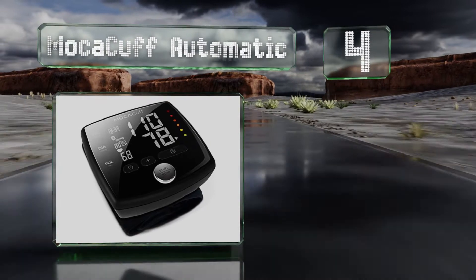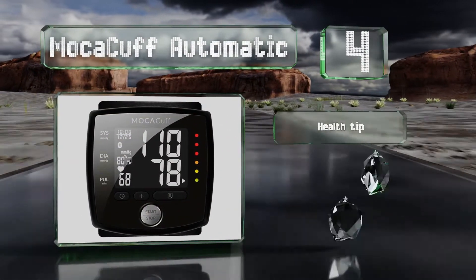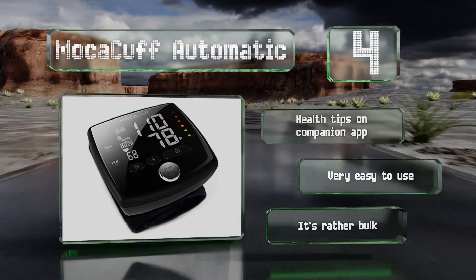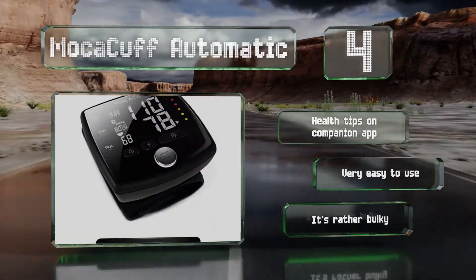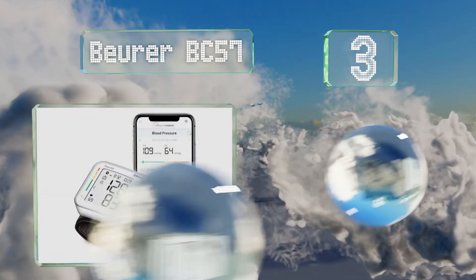At number four, the Mocha Cuff Automatic syncs wirelessly with most Apple and Android smartphones and can deliver immediate results that can be sent to any medical provider. A color-coded measurement indicator corresponds to the data standards set by the American Heart Association. It features health tips on its companion app and is very easy to use; however, it is rather bulky.